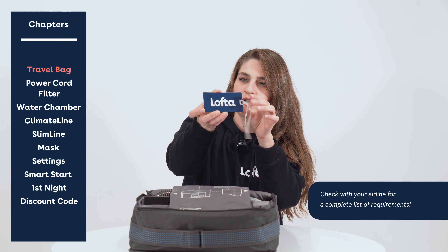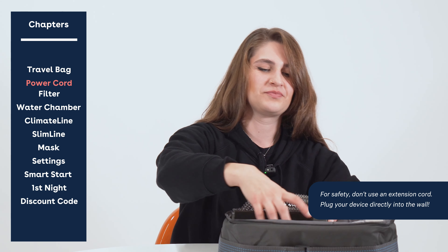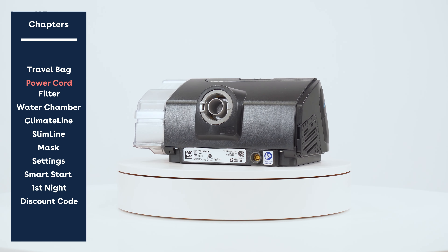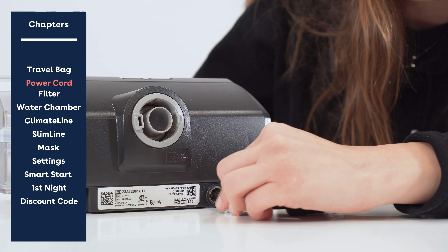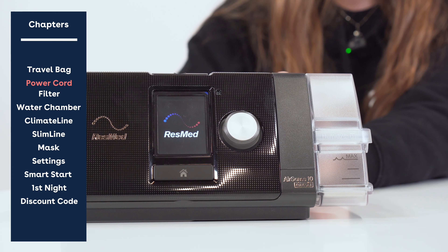First things first, we're going to put this power cord together — just slap it together like so and make sure there's a nice tight connection. Then we're going to insert it into the back of your unit, and as soon as you insert it fully you should see your screen light up and say ResMed on the front.